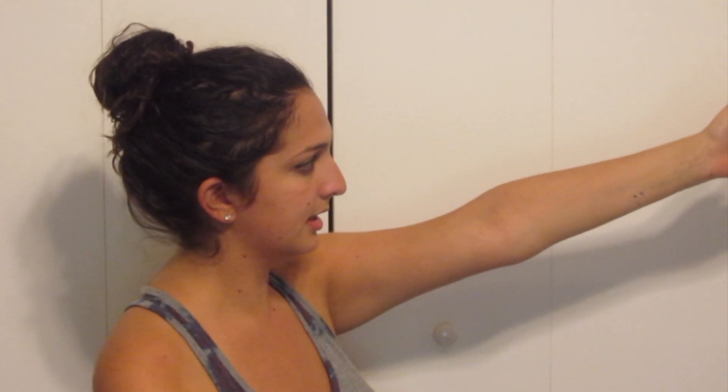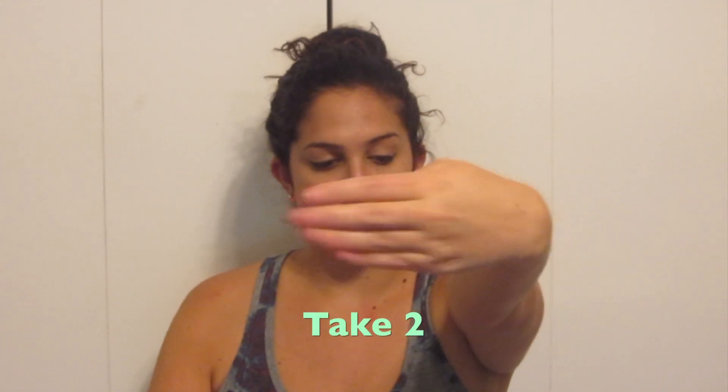The way you get your muscles to move is by doing the following: you stick your arm out, and with the shorter arm you have to think about moving your hand towards you. So going inwards, you're isolating your wrist — not your elbow — and by doing that it moves your exterior muscle. Then to activate the interior one, you're doing an outward motion like so. I've got two reading sites — interior and exterior. In the first set of videos you'll see exactly how that mapped out. It's a lot harder for me to do this side and a lot easier to do this side.